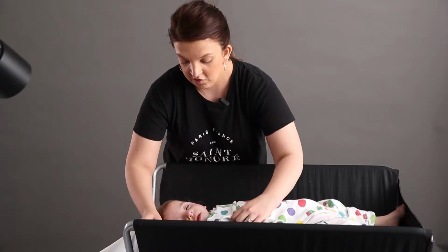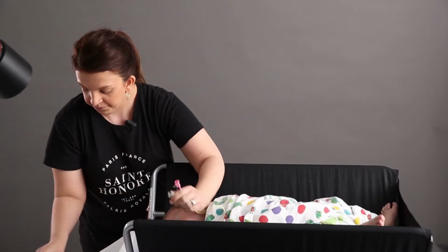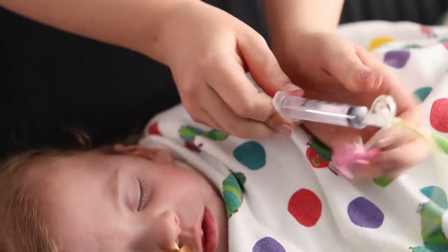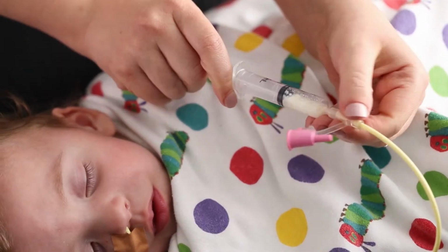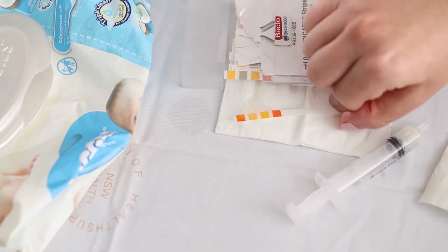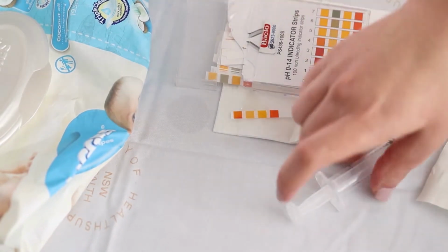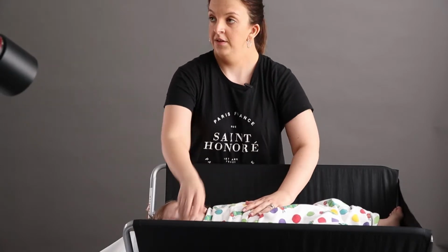What I like to do, to make sure that it is in the right position, is aspirate. So I get my little syringe and I make sure that everything is in position. And as you see, there's a lot coming out there. And I use my pH strip and just make sure it's in the correct position, which it is. It's giving me a nice number there of 4. Perfect. And now we're ready for a feed. That's it.